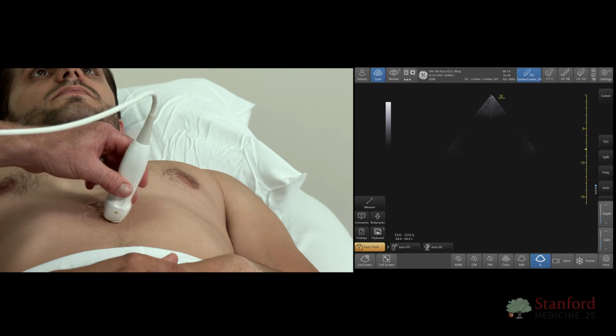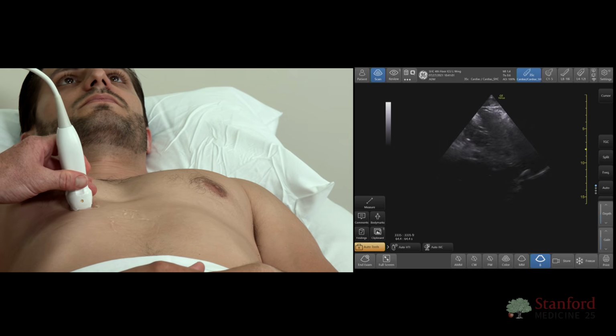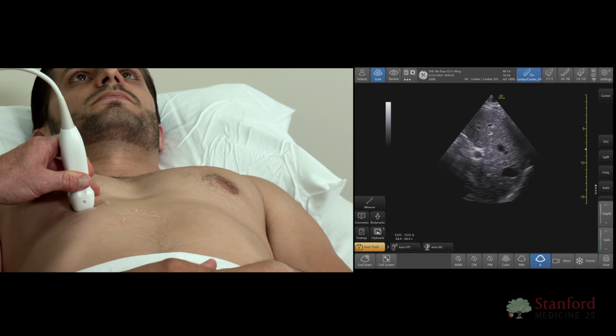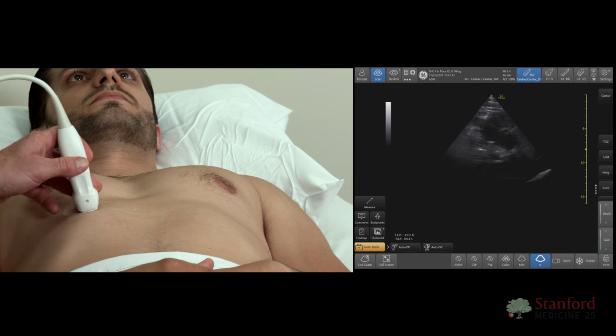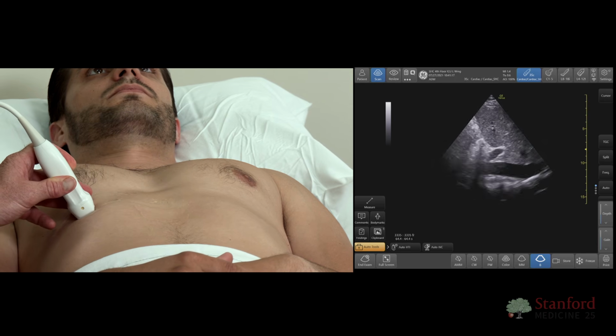If this area is not working, you can try to go up onto the ribs themselves. Now, you need to look around to see, can I get a good spot here? All right, where the picture's nice and clear, all right? And that can take a little bit of movement. Sometimes you just land it right on it, perfect, okay? But what I'm going to do is slide around here and then say, oh, look, now I've got a good picture of the IVC.